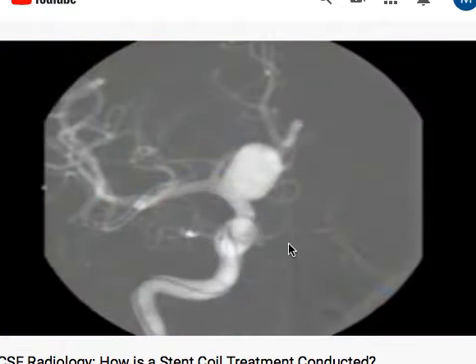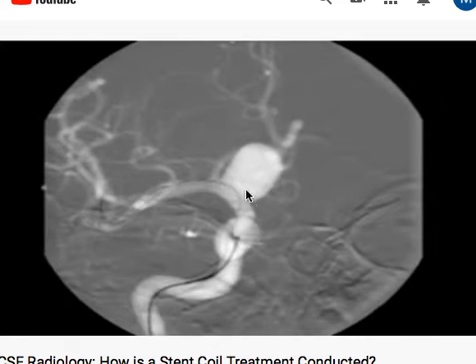What they're showing you right now is a live version of an angiography procedure. So it's got the contrast in there. You can see the wire catheter coming up through here. They're going to go past that. It's nice and slow. Then they're slowly pulling it back just a little bit here.